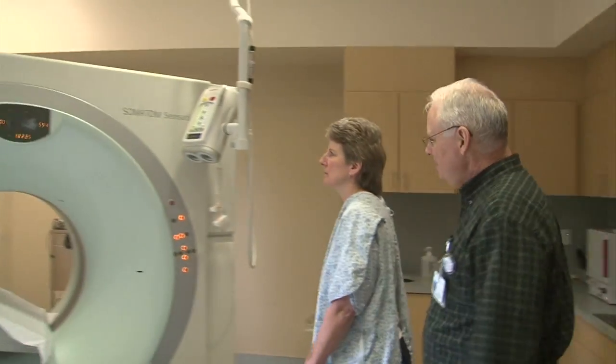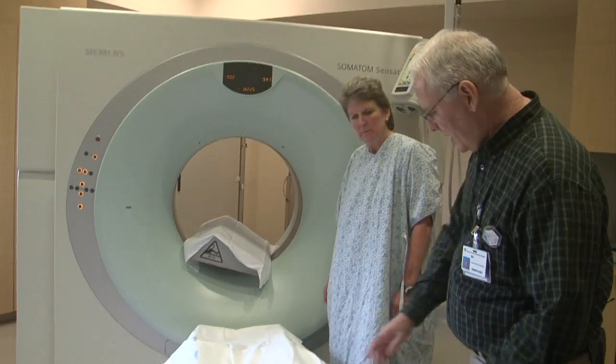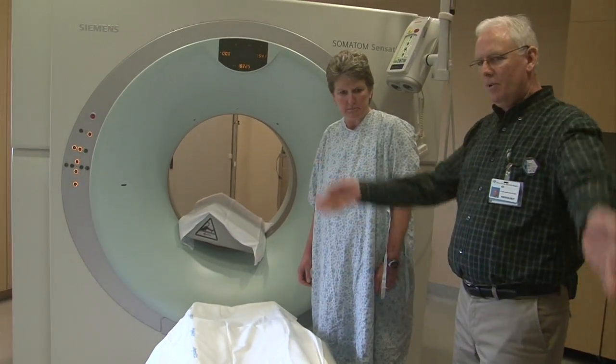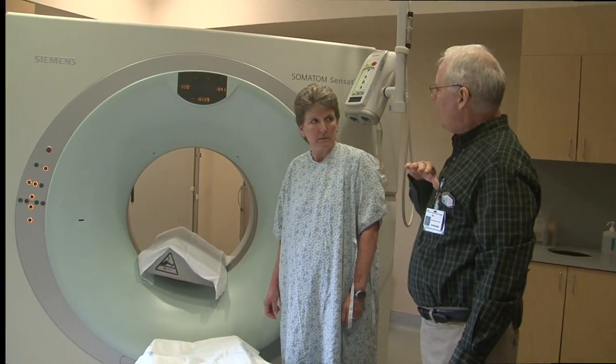For this exam, I'm going to have you lay down on the table on your back. I'll give you a cushion under your knees. You'll put your arms above your head. And then I'll move you into the machine about mid-chest.